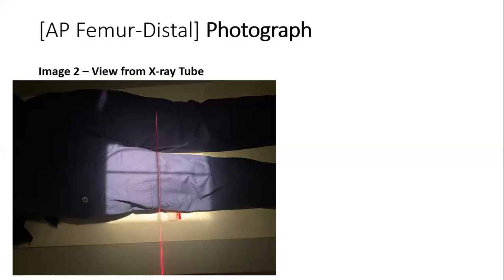The anatomy demonstrated in this image should be approximately two thirds of the distal femur, including the knee joint. The knee joint will not appear fully open because of the divergent X-ray beam. Items in profile for this image should include the femoral condyles and the intercondylar eminences centered to the tibial plateau.